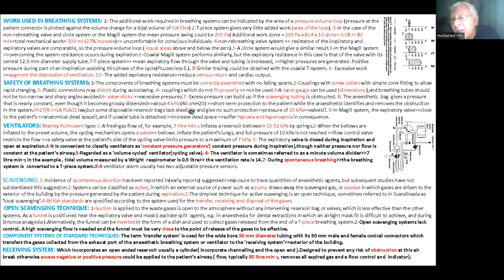Of course, there is the advantage of this inflatable bag we have in the system. Whenever I apply the Laplace law, pressure equals T on R, this shows the advantage of the elasticity of the bag. So the bag can be much increased in diameter, yet the pressure is preserved.